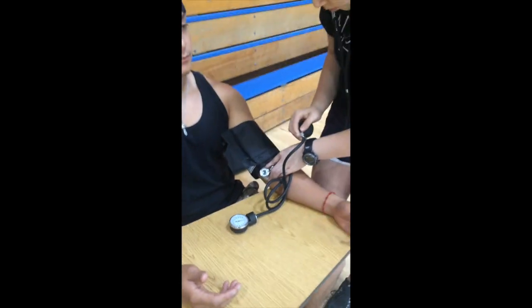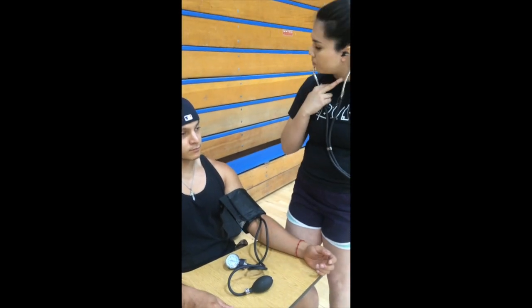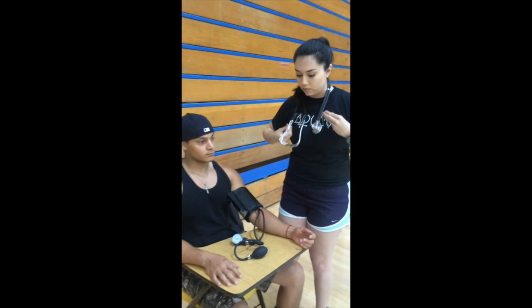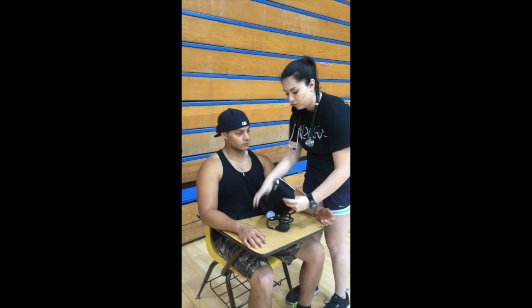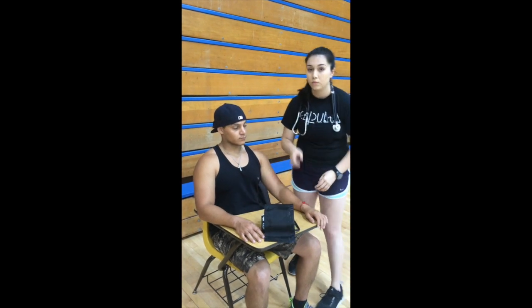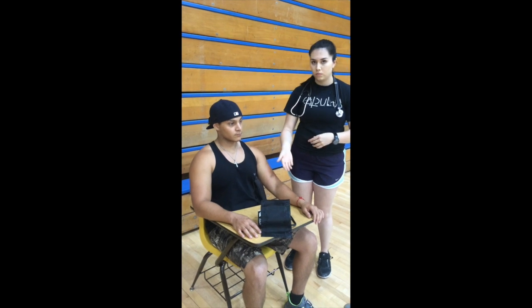After you have acquired your measurement, release the rest of the air from your blood pressure cuff by turning the knob completely to the left. Remove your stethoscope, place it around your neck, and remove your blood pressure cuff from your client. Remember to allow at least one minute of rest before proceeding with the following measurements.